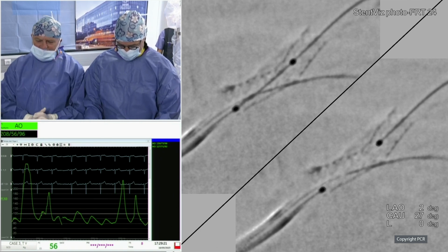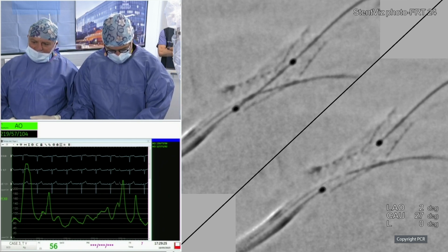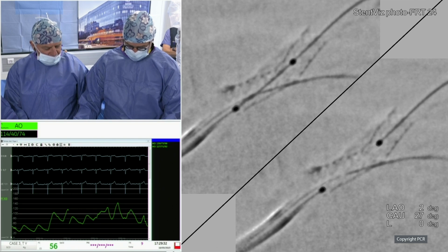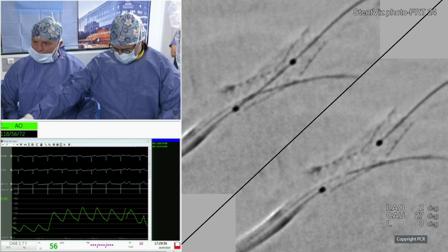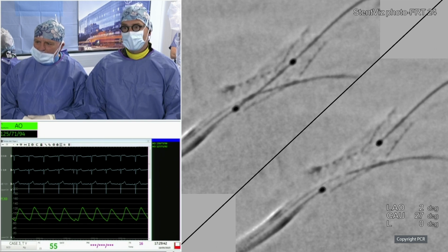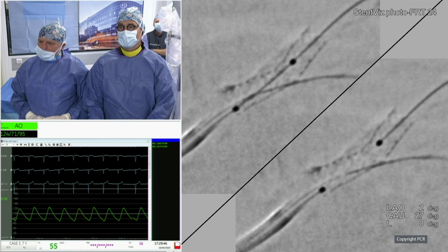So I think that this image is, for the moment, quite satisfying for the left main and the proximal LAD. And now the next step is to maybe recross toward the circumflex to do the kissing and probably a final pot. A small additional point is that the remnant of the contrast is behind the struts. Yeah. That's good. Probably you have sealed some kind of dissection there, just enough.